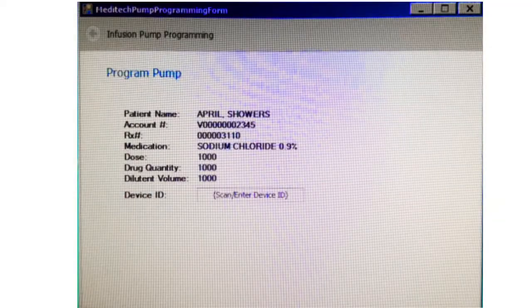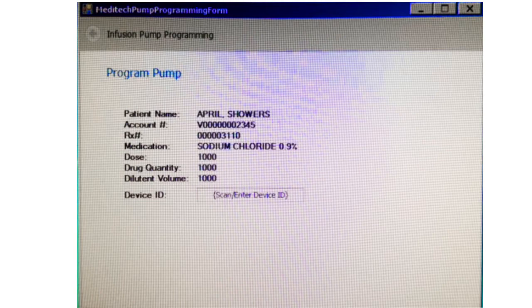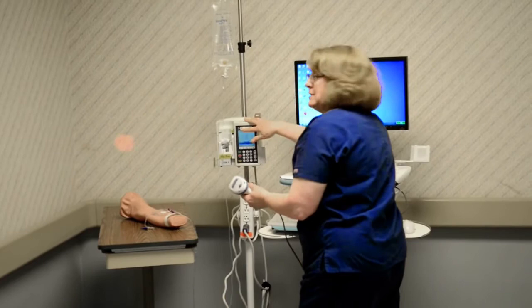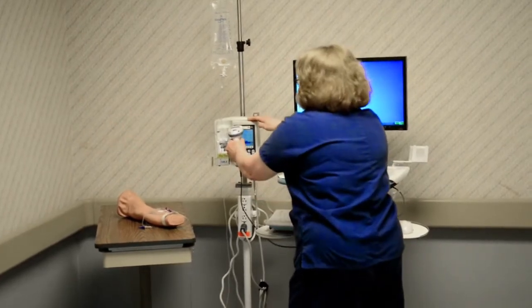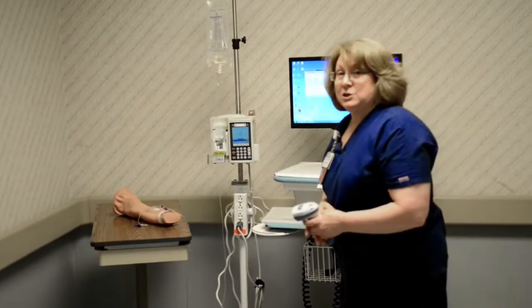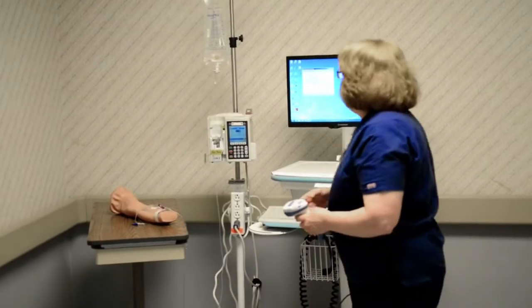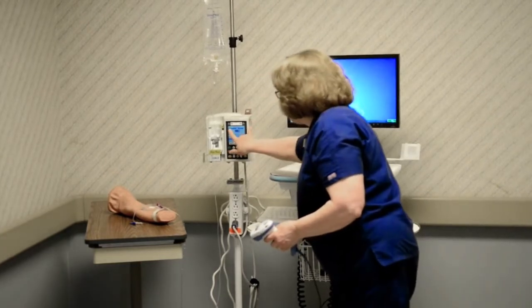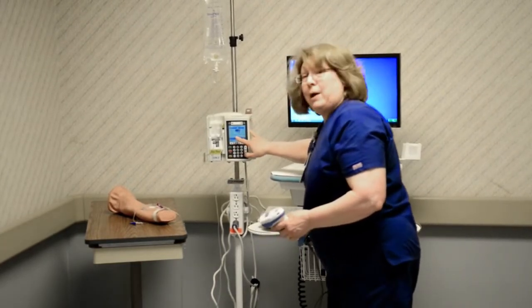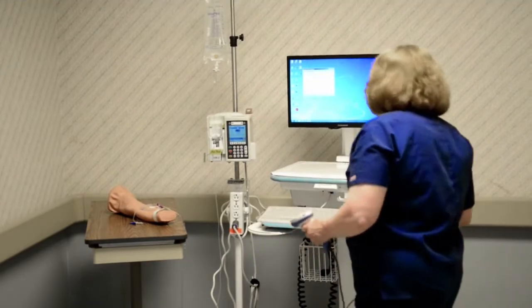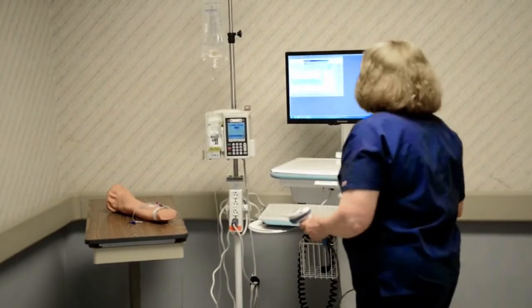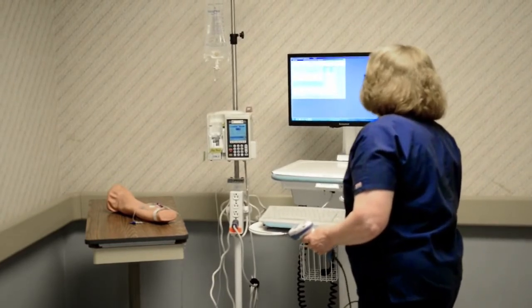It's going to take me to another pop-up screen where I'm going to put my cursor in the field that says device ID. At this point, I'm going to scan the barcode that's associated with the channel I'm going to use. It's now sending the physician's order to the pump, and what's going to come across is whatever's contained within the order. So at this point, I can see my IV fluid, I can see my rate, and I can see my volume to be infused. At this point, I close the pop-up box, and then I continue the scanning process.